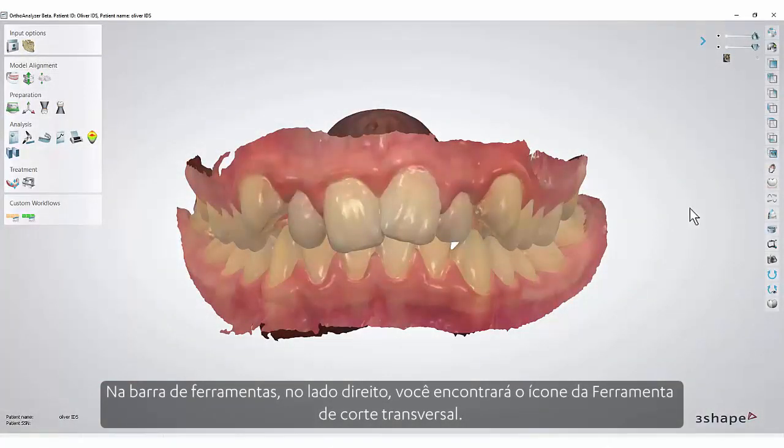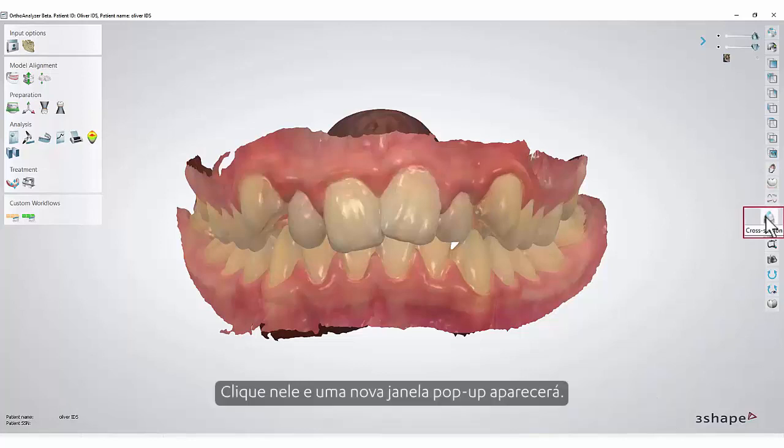In the toolbar on the right side you will find the cross-section tool icon. Click it and a new pop-up window will appear.